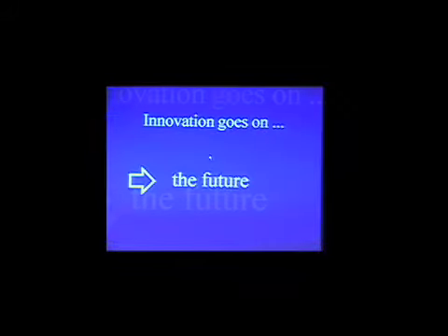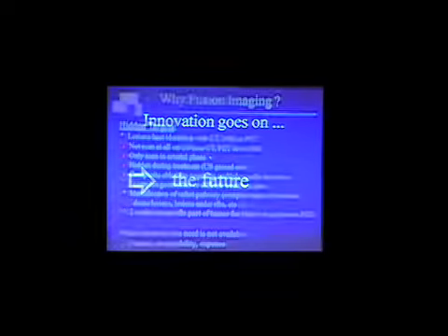In technology, unfortunately, when things change, usually they improve. So we have some improvements. And this is the future. I will show you just a few minutes, really, the last few minutes of my presentation regarding the future. But this, in my opinion, is the most important, most crucial part of that. Probably this year in Chicago, at the RSNA, at the end of November, most of what I show you now will be clearly visible.